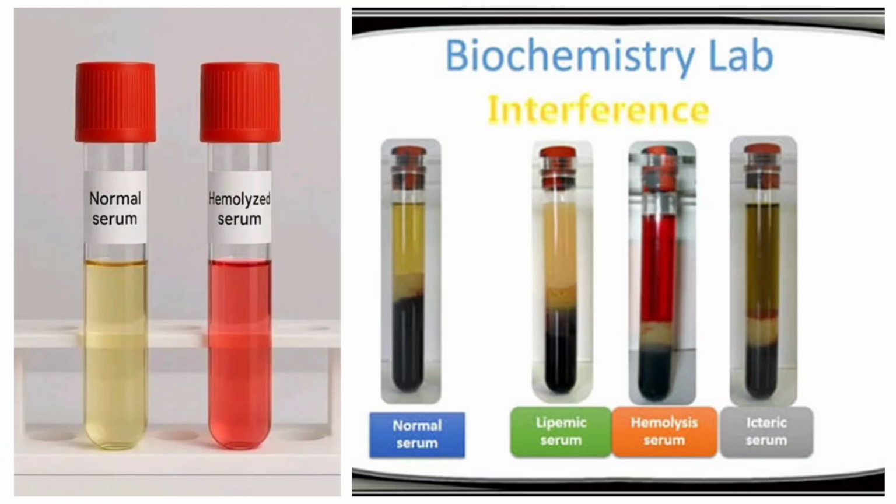Because this serum you are seeing here has been used to generate the standard curve, the calibration curve, and the linearity, the straight line graph, any result that is not consistent with a normal serum would interfere on that very sensitivity, on that measuring range. Why? Because it has been measured and the linearity has been generated using a normal serum.